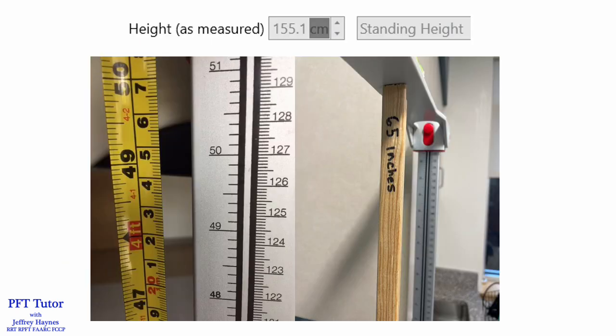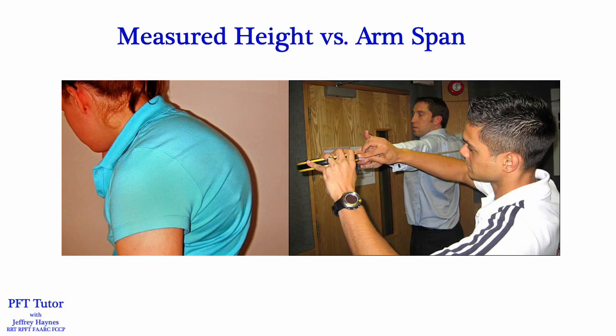The other important demographic to verify is height. If we record and enter a height lower than the correct height, the z-scores and percent predicted will both be inaccurately high. As I mentioned in my video about height measurement, stadiometers may not be accurate and should be checked for accuracy periodically with a measuring stick for QC. There are some patients in which standing height can be misleading. For example, if a patient has significant kyphoscoliosis, the standing height may give a misleading view of what their lung size should be, and their z-scores and percent predicted will be inaccurately higher.